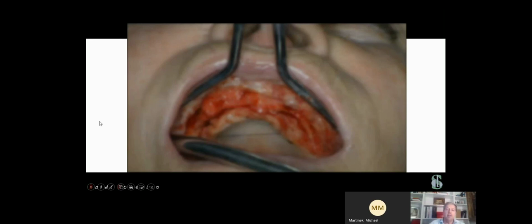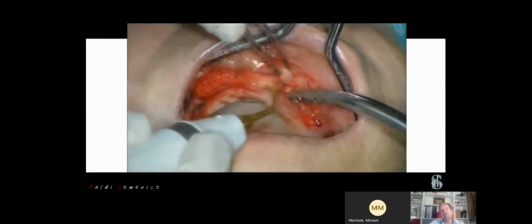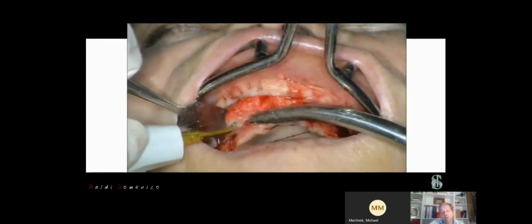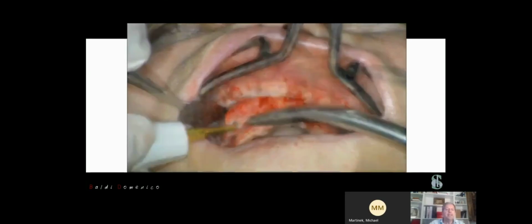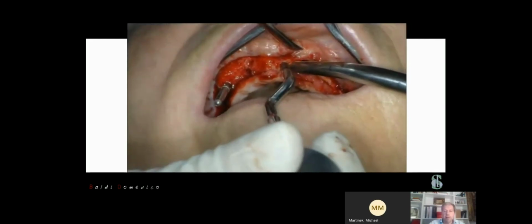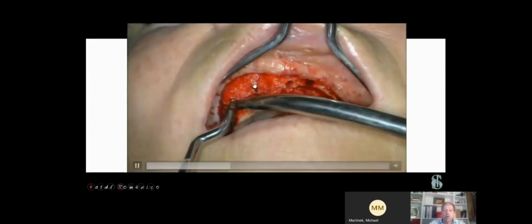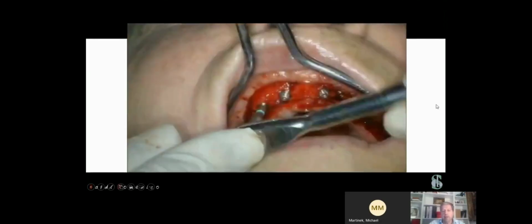But during the surgery, of course, we have to analyze the whole situation. Look here. You can see that the regeneration was good. Of course, it's necessary to clean it and smooth the bone in order to have a good quality and a good quantity of bone. Then we can start with ultrasound in order to be less invasive in the place where we had a bone regeneration. And after we can continue our implant site preparation with the magnetic mallet. And again, you can see how it's possible to have an osseodensification and an expansion of our bone. So we can place the implant without problem.